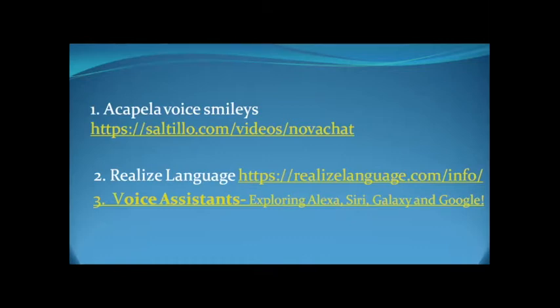Tell me how that works then. It communicates with, like, Alexa? Yeah, you've got an Alexa? Yep, she heard it. Okay, so it listens to, Hey, Siri. And here's Alexa. Hey, Google. I just want to get the volume up. Julia loves Alexa.